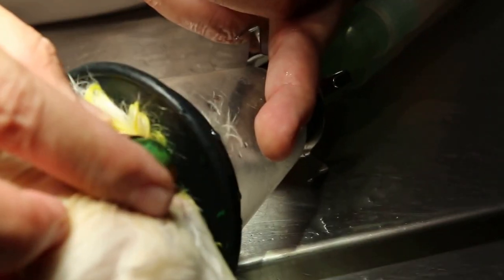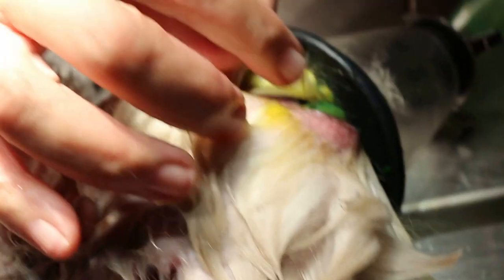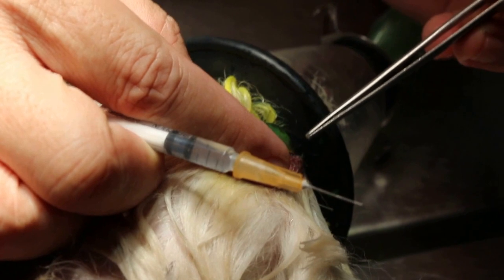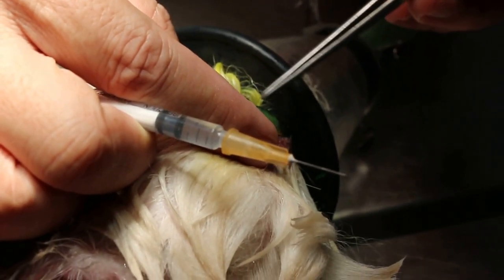The dog has dry eye and has been rubbing its eyes. With this fluorescent stain test, you can see there are quite a lot of ulcers. The ulcers are the areas stained green, from 10 o'clock to 3 o'clock, and there is a deep ulcer here.